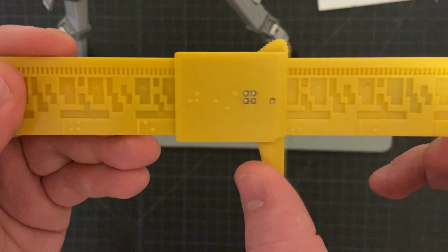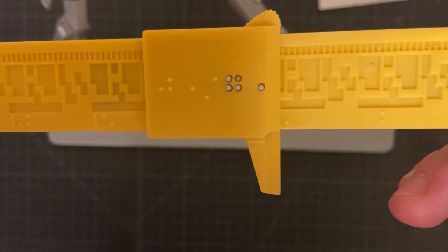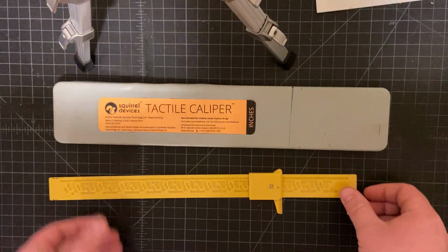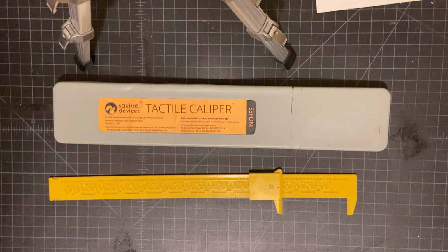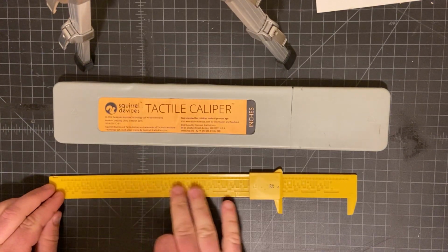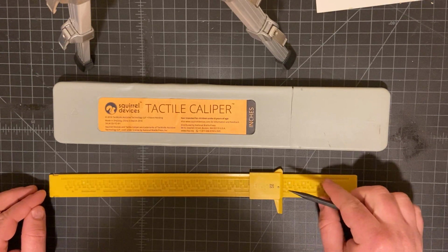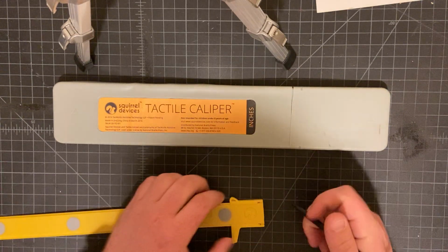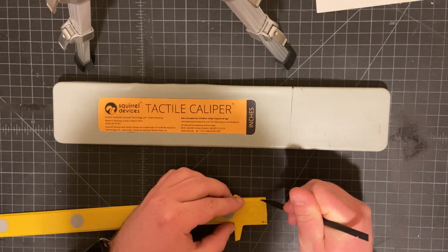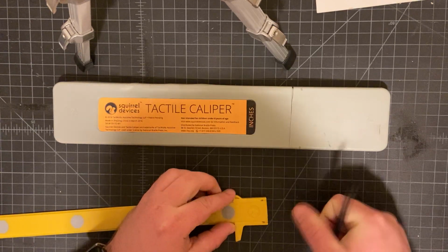So that is just a really cool device, and I'll take off the slider and show to you kind of how it works. So I'll put it down to do that. So yeah, I saw this a while ago. I just was so impressed. So along the surface of the main scale, there's all these indentations, and that is what makes the magic happen. So I'll slide the slider all the way down to the end, and then I'll use this little thing called a spudger to poke down the holes that are keeping it on there, so I can take it off.